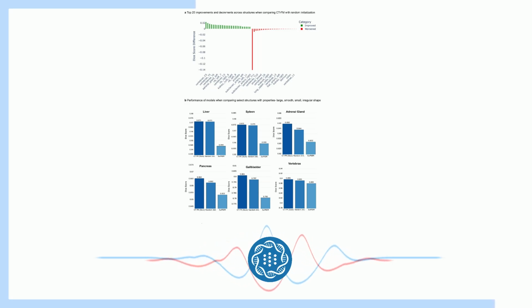Okay. So it's like highlighting the parts of a picture that the AI is paying the most attention to. So what did those saliency maps reveal? Was CTFM focusing on the right areas? Yeah, the results were really fascinating. CTFM was consistently drawn to key anatomical landmarks, things like the lungs, the heart, the diaphragm, the vertebral column, and the pelvic girdle. It's as if it's learned to prioritize the structural framework of the body, just like a sculptor might focus on the skeleton before adding all the finer details.